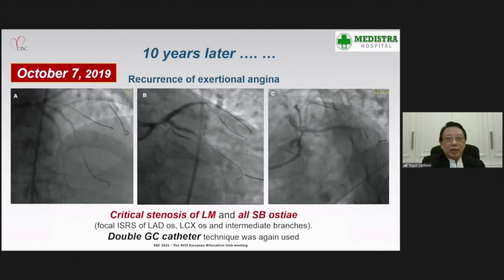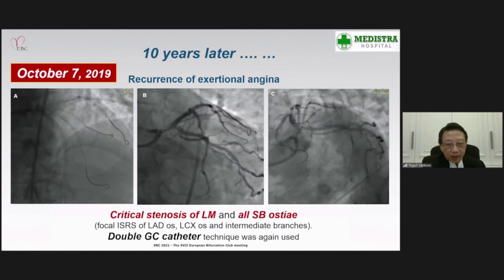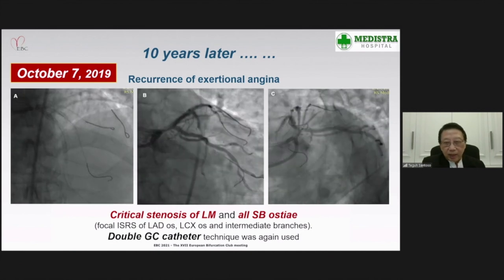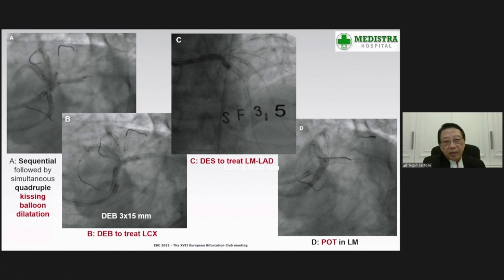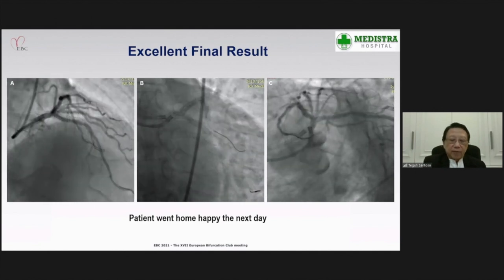10 years later, the patient showed up again because of recurrence of exertional angina. This time, the left main had a very nasty-looking lesion, diffuse and critical stenosis here, and there was a focal in-stent stenosis in the ostium of the LAD, LCX, and all the side branches. So again, we had to use double guiding catheter technique. Shown here, we did the sequential followed by quadruple kissing balloon dilatation, and we used a DEB to treat the LCX stenosis, and DES to treat left main to LAD narrowings, and then we finished the case with POT in the left main. And we obtained an excellent result like this. The narrowings in the intermediate branches were left as they were.